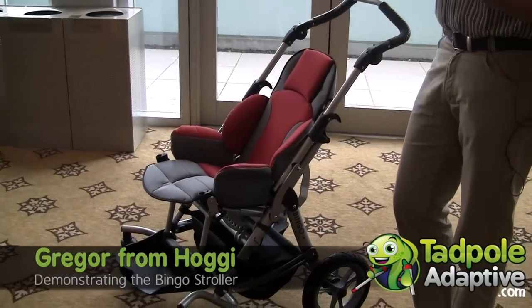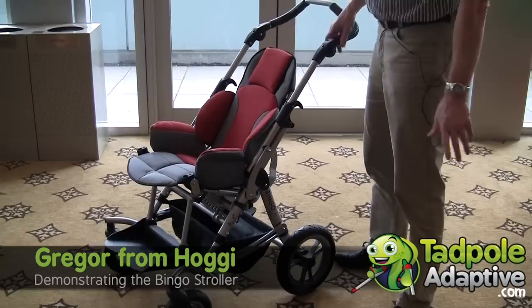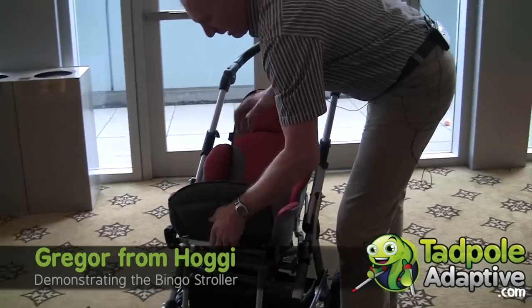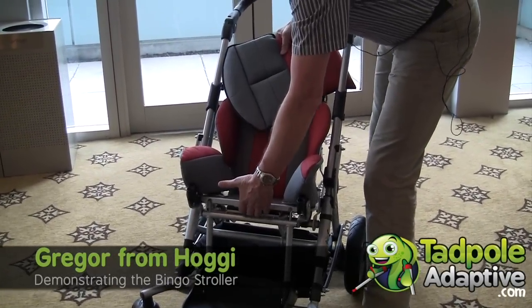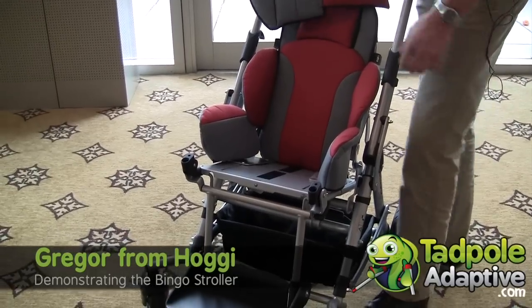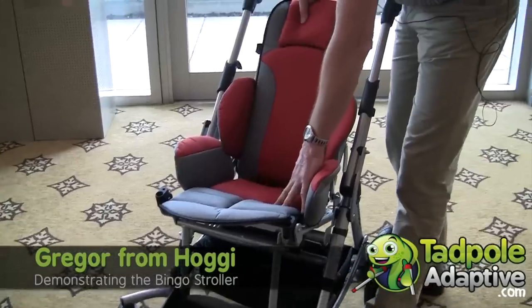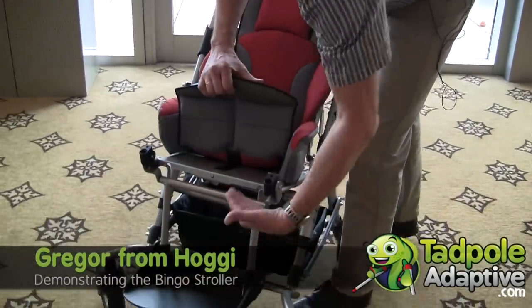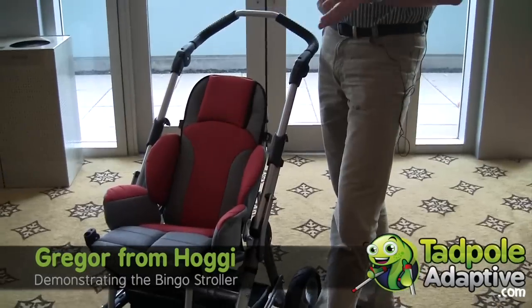It has many adjustment possibilities and growth capacity. Starting with seat depth adjustment — very small, from 16 cm up to 34 cm. Then we can grow the back in height. We can also adjust the footboard, lower it or raise it. This covers the main dimensions and sizes.